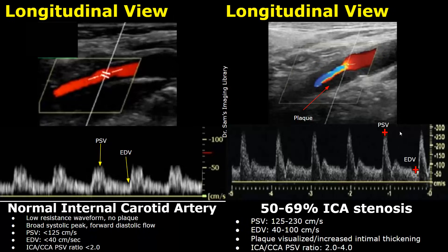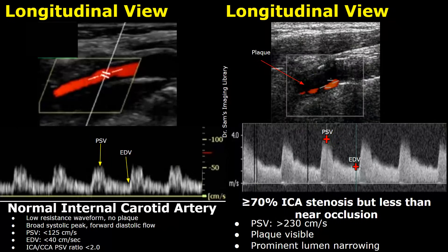Here, the PSV is between 250 and 300 cm per second and the EDV is between 50 to 100 cm per second. A stenosis of more than 70% but less than near occlusion is considered if the PSV is greater than 230 cm per second, and a large visible plaque is seen along with prominent lumen narrowing. Here, we can see a very small amount of flow right next to a large plaque, indicating significant lumen narrowing.